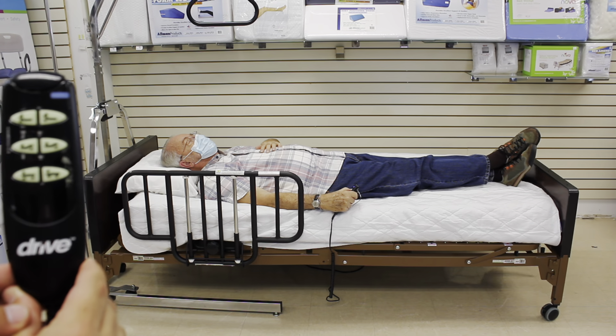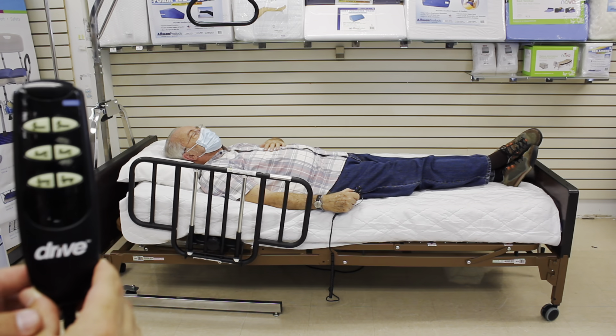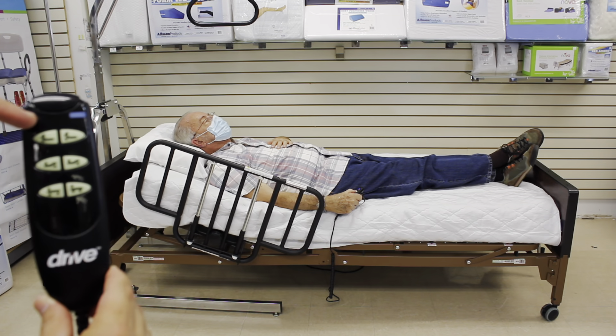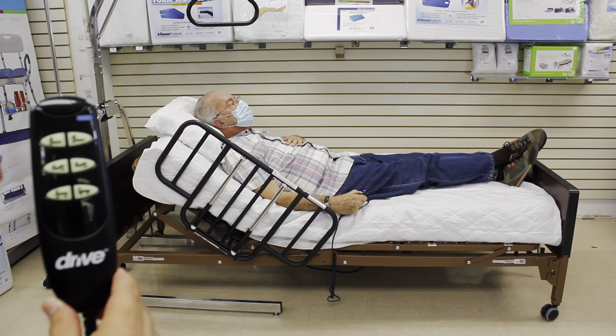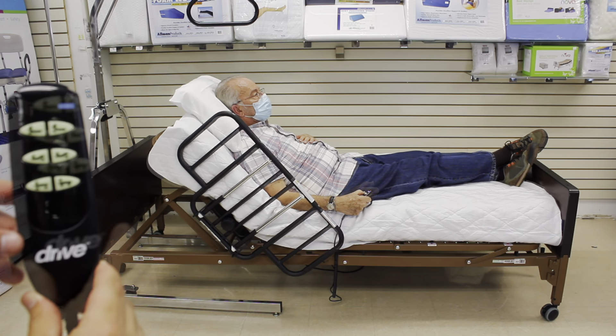Allow me to demonstrate the functions of the hospital bed. As you can see, when you push the top two buttons located on the control, it moves the head of the bed up, allowing the rail or half rail to move along with the bed, thus keeping the patient secure while the bed adjusts.